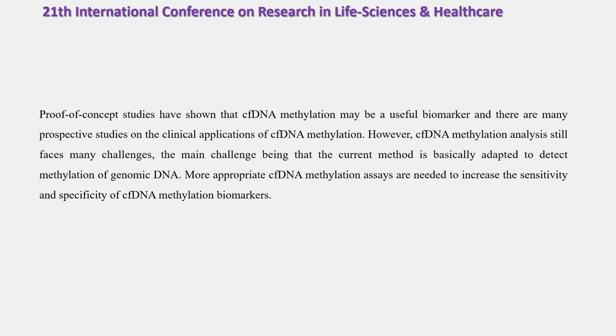However, cfDNA methylation analysis still faces many challenges, the main challenge being that the current methods are basically adapted to detect methylation of genomic DNA. More appropriate cell-free DNA methylation assays are needed to increase the sensitivity and specificity of cell-free DNA methylation biomarkers.